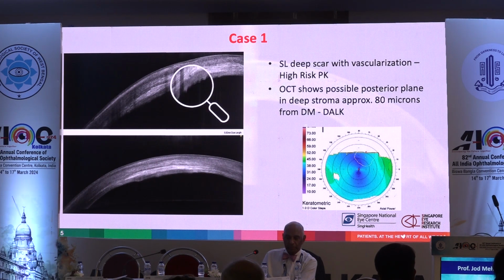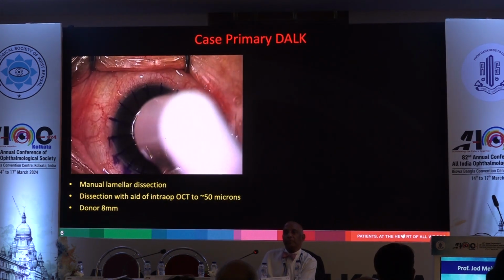But if you look a little more closely at the ASOCT, you'll see these little ridges on the endothelium, and this is something to be careful of when you're doing herpes simplex cases, because this is actually a fold in Descemet's membrane. I'll show you how it can have an effect directly on the surgery.